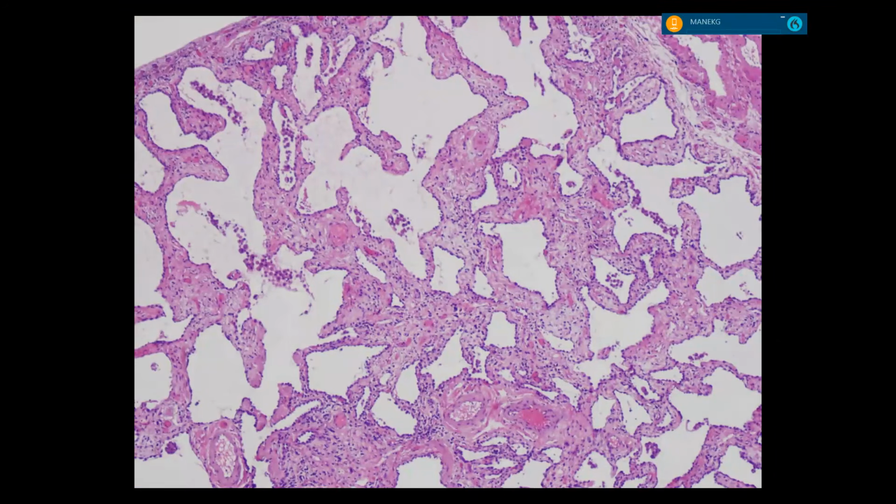Okay, this is fair. A 48-year-old woman with scleroderma. Lymphocytic infiltration, yes, but no giant cells. And what are those? Here, that's a blood vessel with endothelial cells. There's blood in the middle of it. See that? Those are blood vessels.